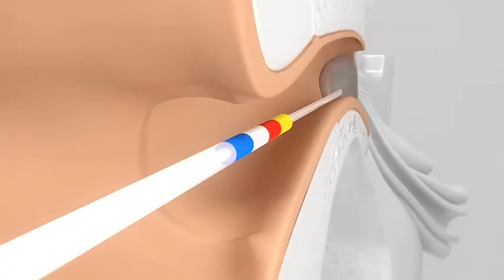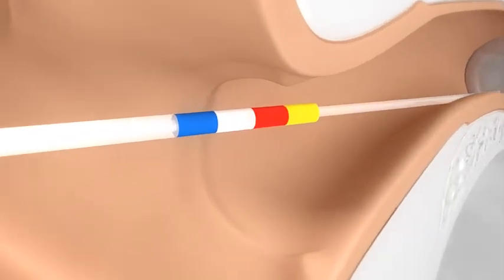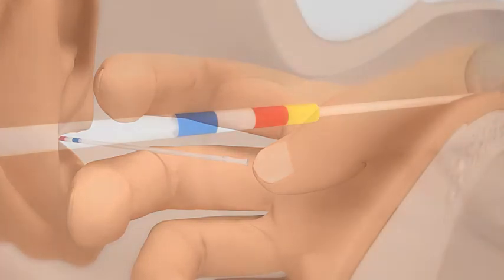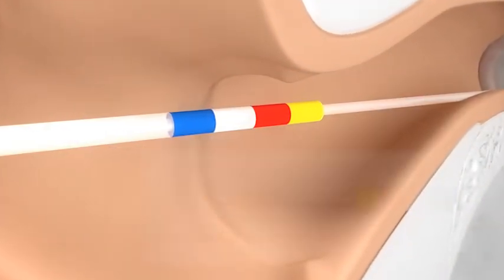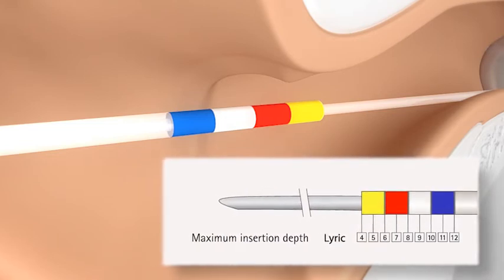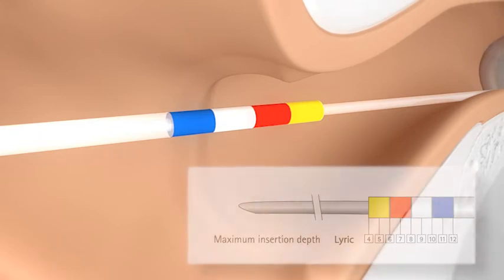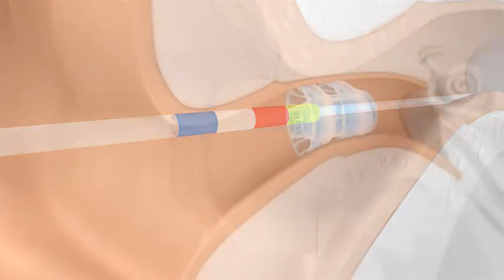If the length sizer is in the center of the ear canal opening, shift it so that it aligns with the posterior meatus. Push gently with your thumb again to ensure it is still touching the tympanic membrane. Note the location at which the posterior meatus aligns with the length sizer. Refer to the length sizer diagram to determine the maximum device insertion depth. In this case, the ear canal has a maximum device insertion depth of 10 mm for the Lyric hearing device.